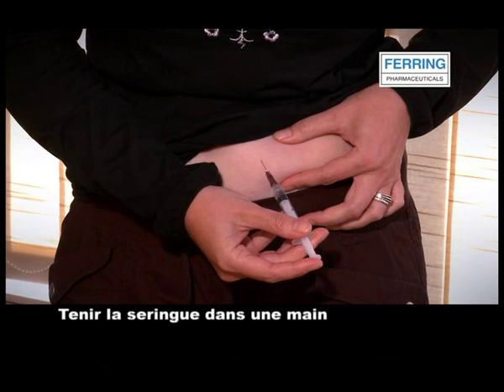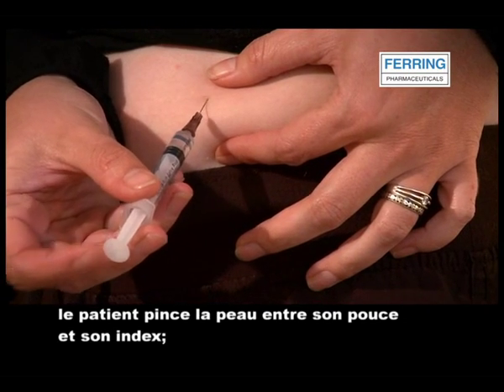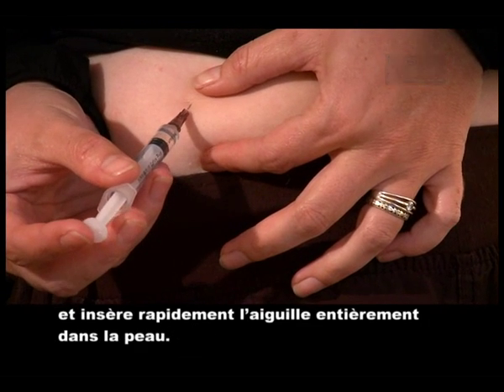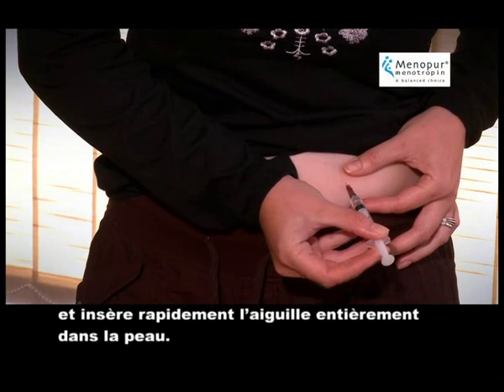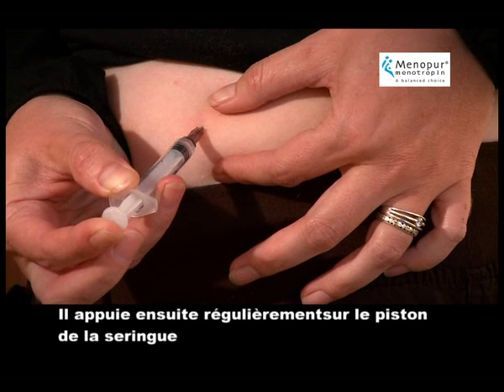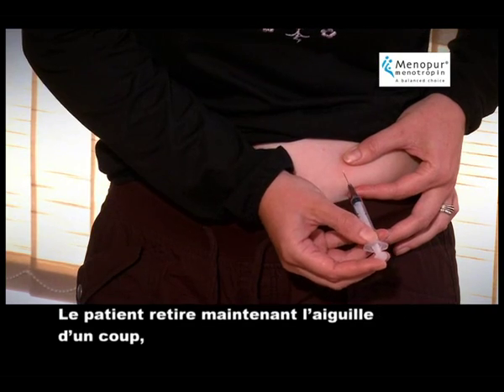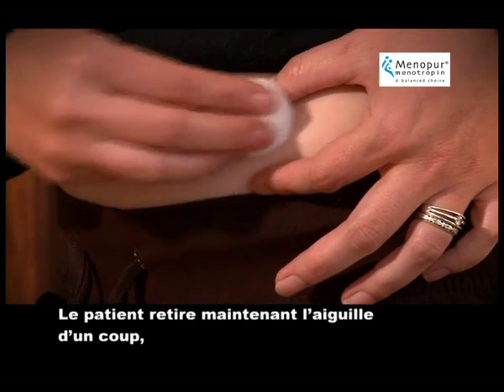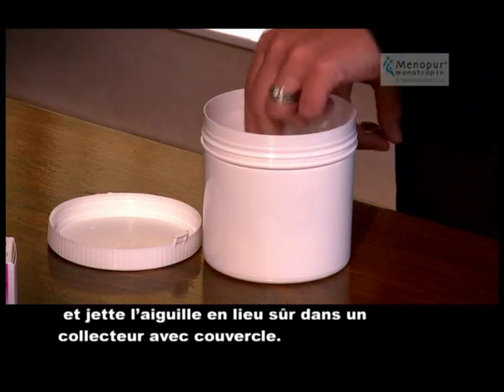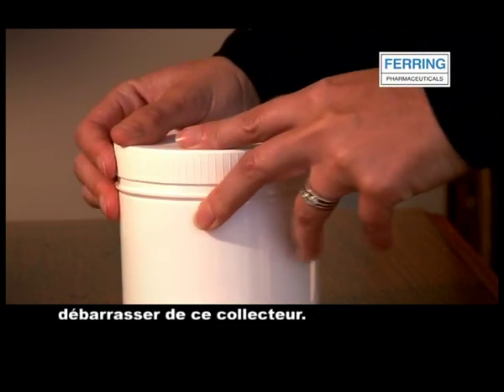Holding the syringe in one hand, the patient grabs the skin between her thumb and index fingers. She holds the syringe perpendicular to her skin, like a dart, and quickly inserts the needle all the way into the skin. She then depresses the plunger of the syringe with a steady motion until all the fluid is injected beneath the skin. The patient now pulls the syringe straight out and discards the needle in a safe disposable container with a lid. Ask your healthcare provider how to properly dispose of this container.